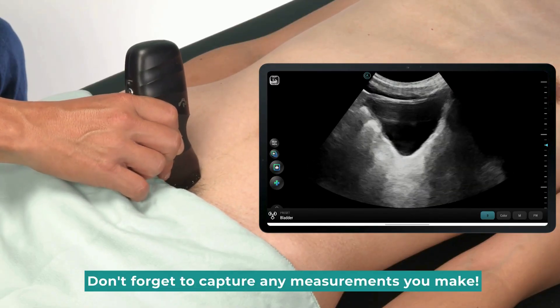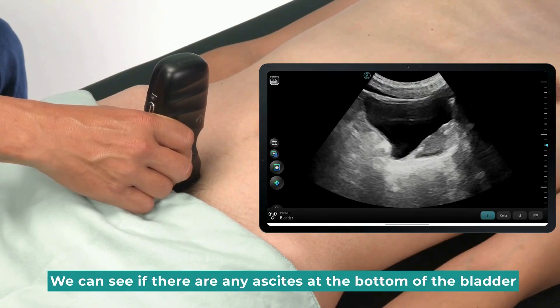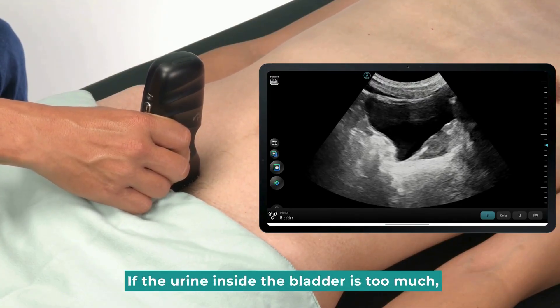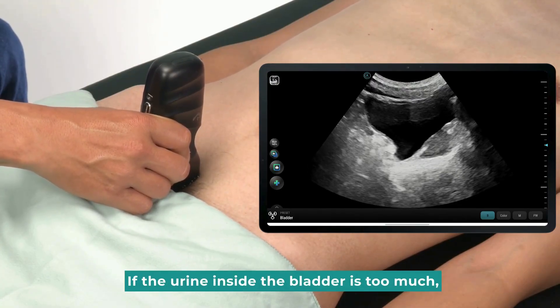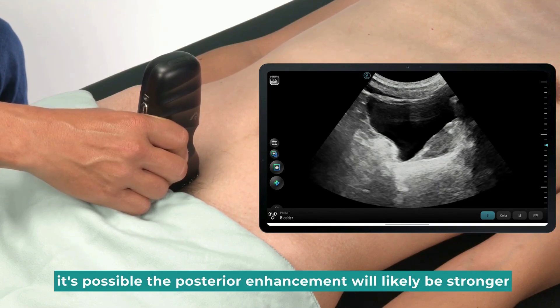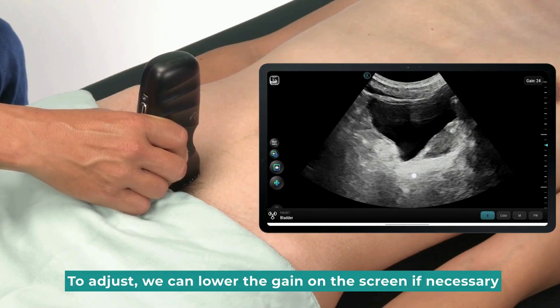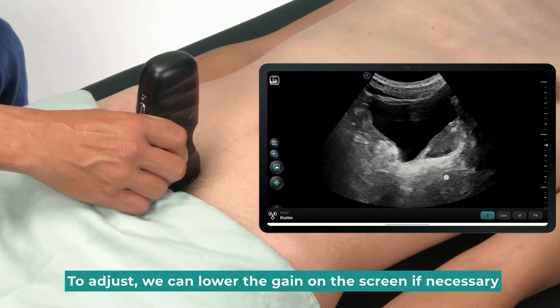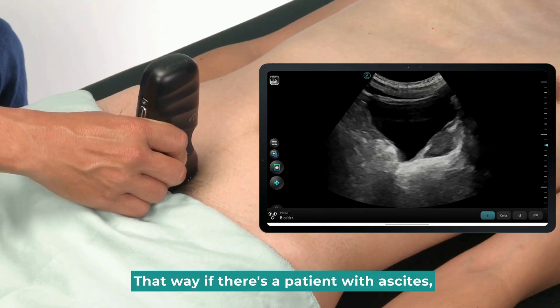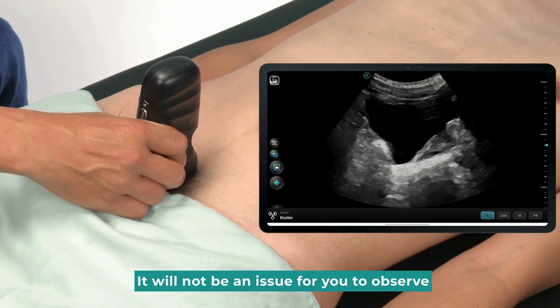Don't forget to capture any measurements you make. We can see if there are any ascites at the bottom of the bladder. If the urine inside the bladder is too much, the posterior enhancement will likely be stronger. To adjust, we can lower the gain on the screen if necessary, so that if there is a patient with ascites, it will not be an issue for you to observe.